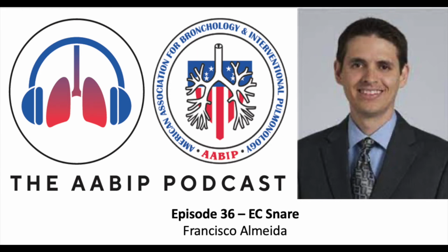They have different shapes. They have the round, they have hexagonal. There's another shape that I don't even know the name of. It's kind of round, and then there's a straight portion to it. And I use mostly the round. I don't know if there's any particular benefit of one over the other. Sometimes when I ask for the round, we don't have it, and then, well, give me this or that. And I don't think I ever noticed any particular difference in how good or bad the outcome was based on the shape of the device. So as I said, I use mostly the round, and that has been working for me for virtually 100% of the cases. So I haven't really tried any of the other shapes.